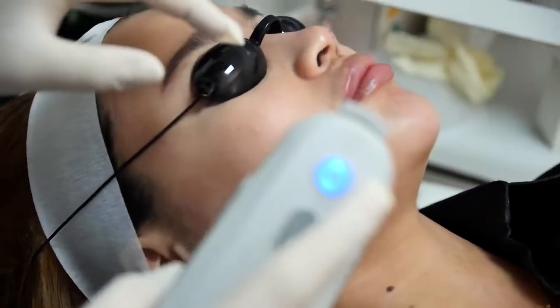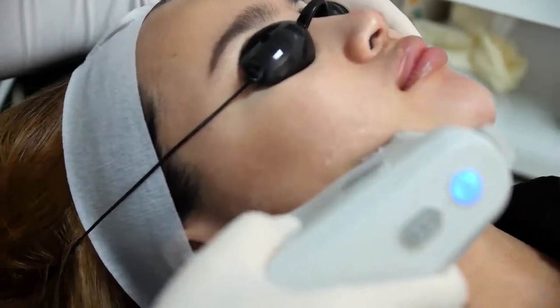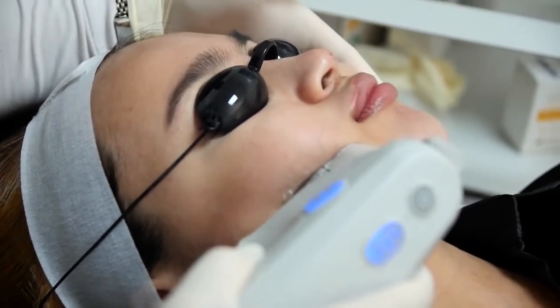And immediately you can already do your treatment, your cosmetic procedure. We'll do our first shot there. How's that, Casey? So far so good? Yeah.